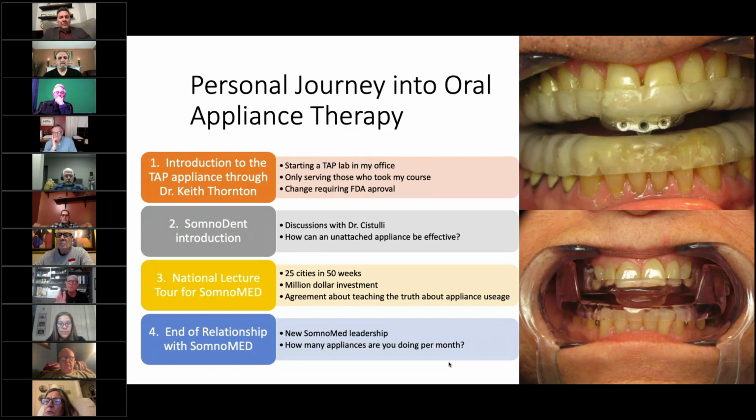Why was I saying that? I was saying that because we know that when the mandible drops open, and the hyoid bone drops, there's altered musculature and there's the tendency to collapse. So you can't possibly allow the mandible to drop open as you can with a dorsal appliance, in my ignorance, and say that can't work. Well, he kept sending me statistics. And it was impressive, and it was showing me how it was working, and it didn't make any sense to me. But there was no doubt about his honesty, and there was no doubt about the statistics.